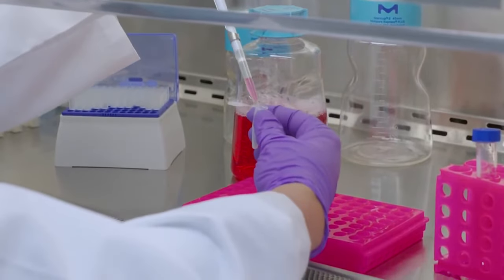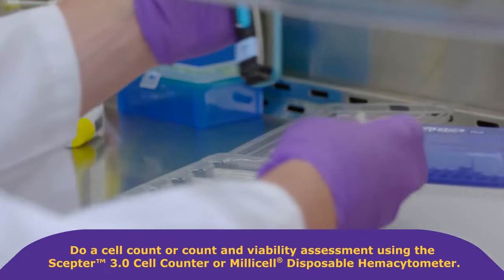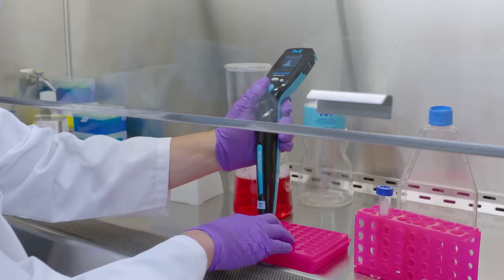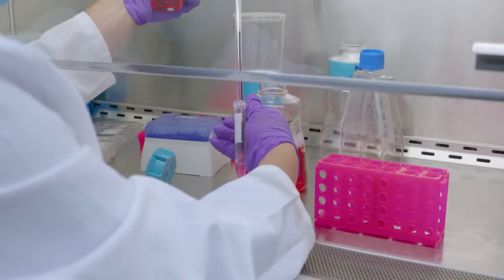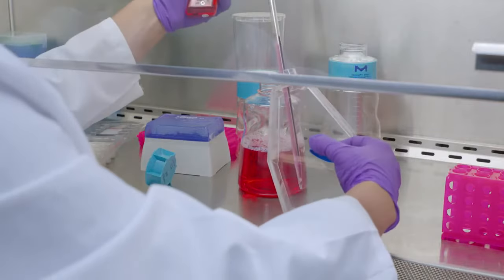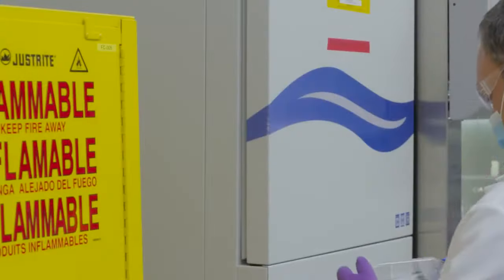Take a small aliquot to do a cell count or viability assessment using a Scepter cell counter or Millicell disposable hemocytometer, respectively. Bring cells to their proper volume. Triturate thoroughly for single cell suspension. Transfer cells to the flask and rock to ensure even spread.